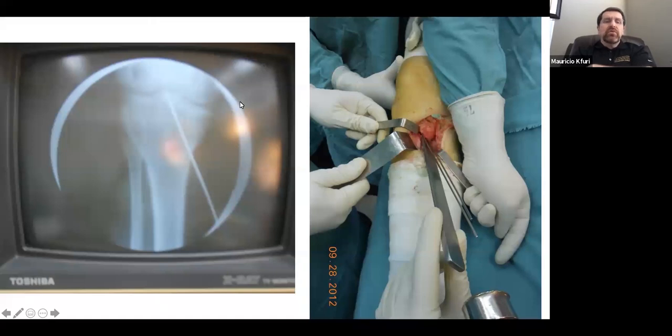One thing that I do for those unicompartmental osteotomies is always to protect the hinge with a wire that comes from lateral to medial. And then by doing that, when I open the wedge, I'm sure that my hinge is not going to break, because when you have a hinge fracture in this particular kind of osteotomy, you're generating another tibial plateau fracture that sometimes may complicate the case, especially in case the fracture extends to the lateral side.